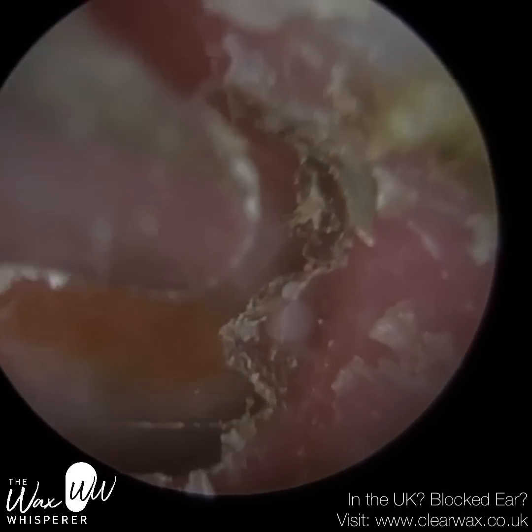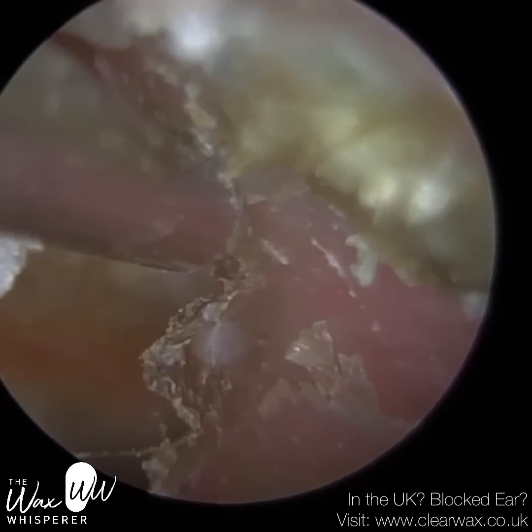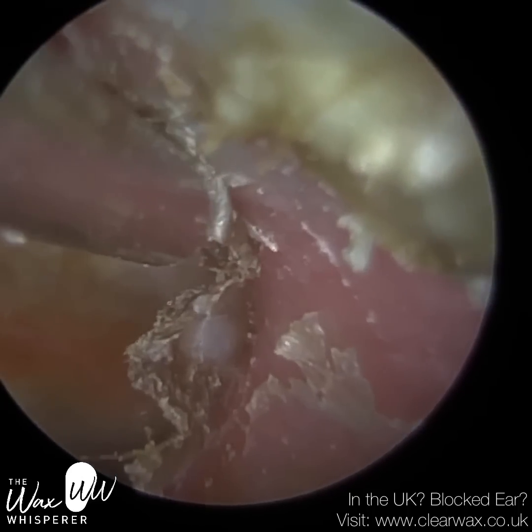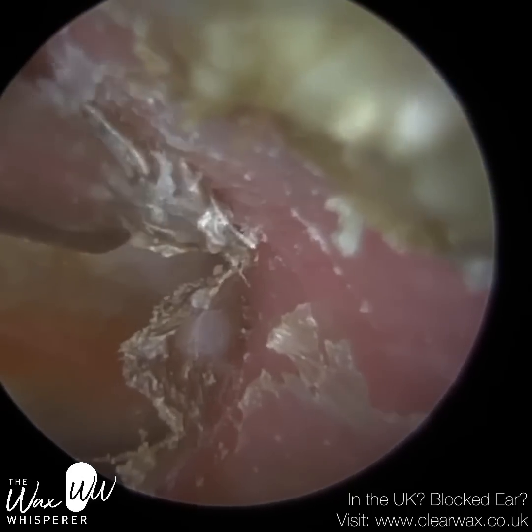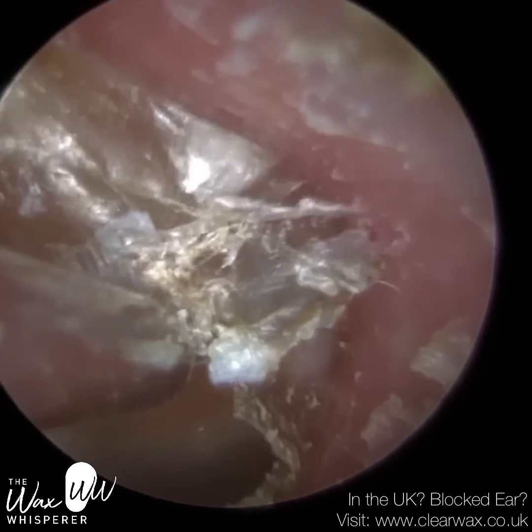We've cleared the ear canal — the majority of it. We've just got this crusted layer of skin now on the eardrum, and this is the most complex part of the procedure. It's been quite tricky so far anyway, but this is where it gets most complex.